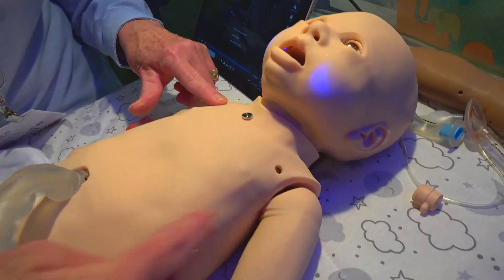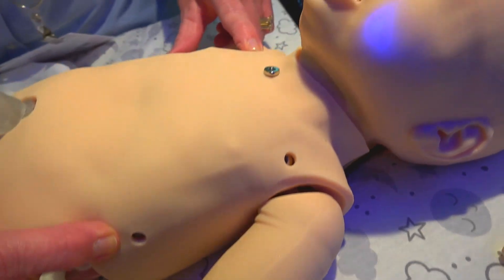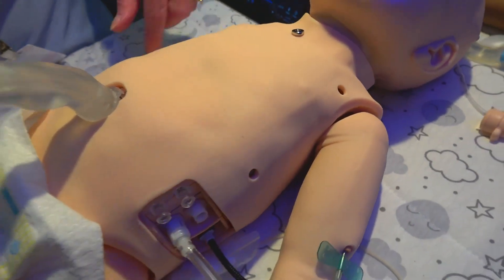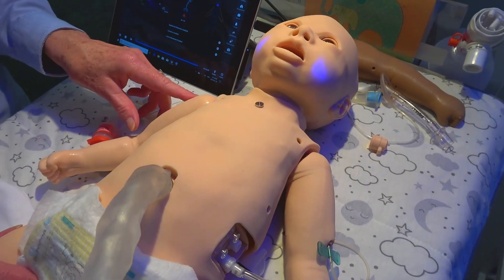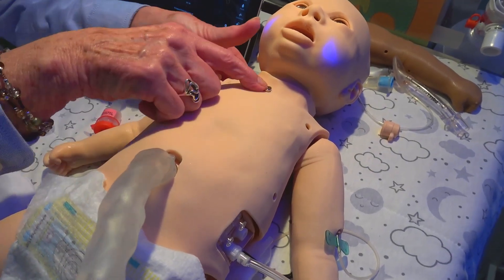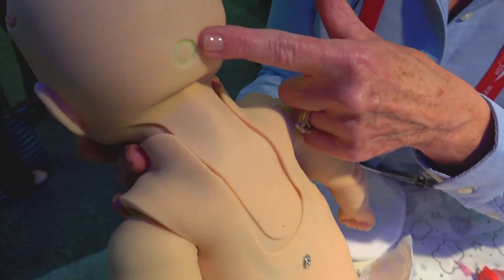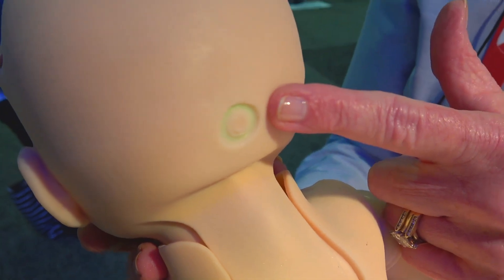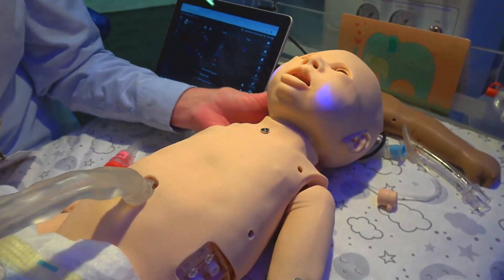She can attach to a cardiac monitor using the three electrode posts — ECG posts — and can also be defibbed using our additional SIM defibrillator, which has anterior and posterior attachments. This is the power button for the mannequin. It turns green when you turn it on, and when your battery is running low it will turn red, and you'll also get an indicator in the software.